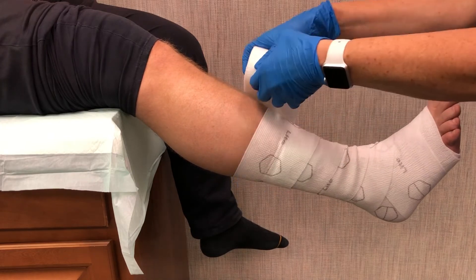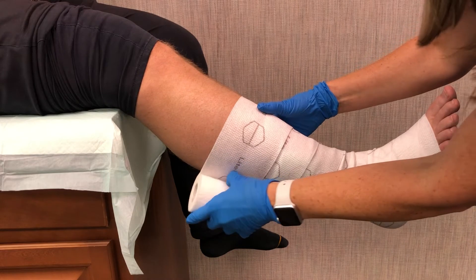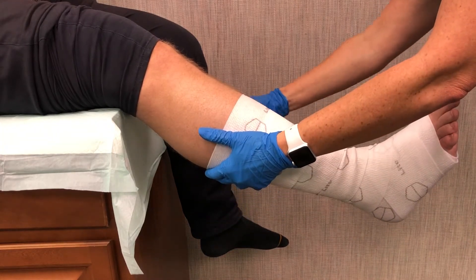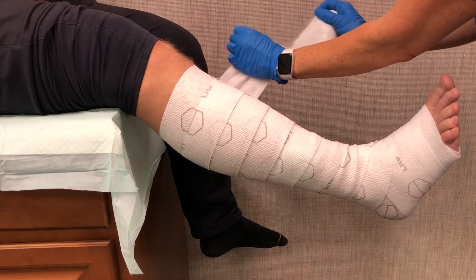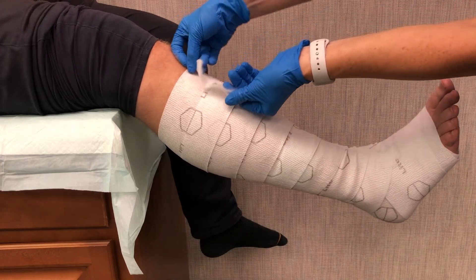The indicator also has a line down the middle to help with the 50% overlap. The correct extension may also be checked with the green cardboard template, which is provided with each kit. Tear off any excess bandage material beneath the tibial tuberosity at about 2 centimeters below the fibular head. Additional fixation is not necessary, but tape can be used if desired.